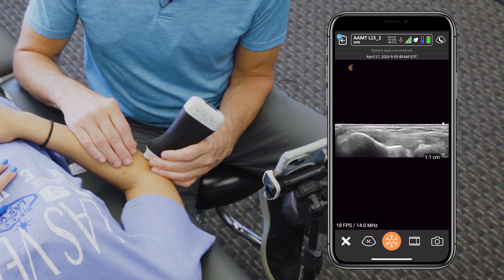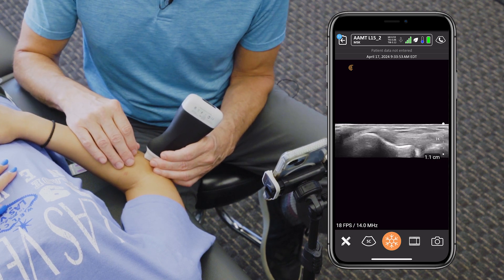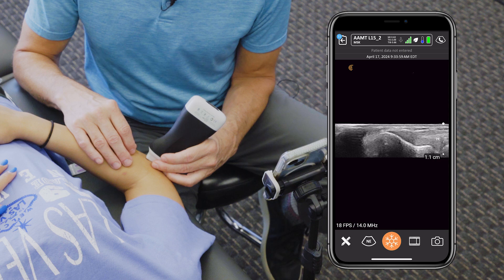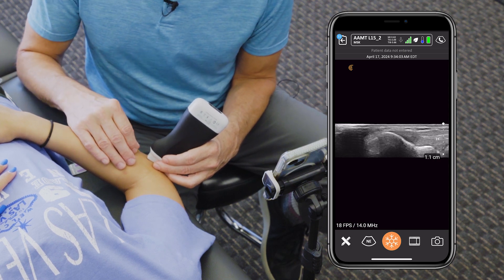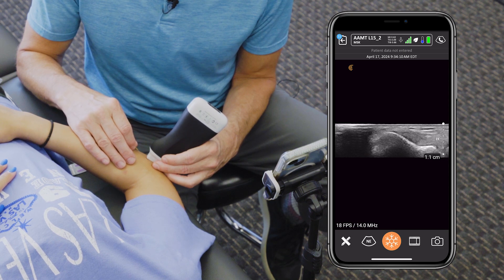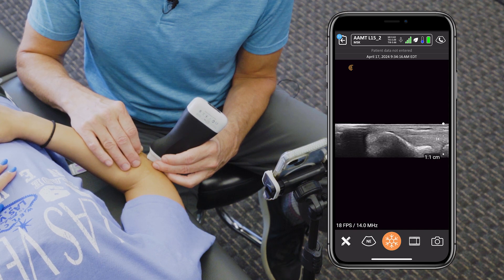Once we get the probe lined up in the longitudinal or long axis position, we're going to slide the probe a little more cranially because we need to get the needle in from a long way. Then we're going to take the needle at a very shallow angle and progress it towards the lateral epicondyle until we make contact with the bony backdrop of the lateral epicondyle.